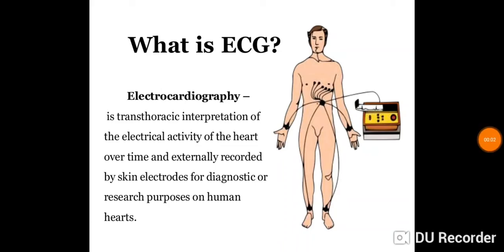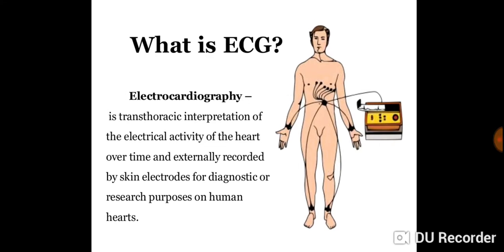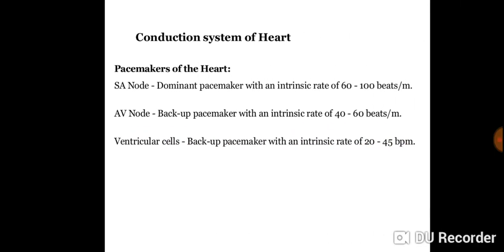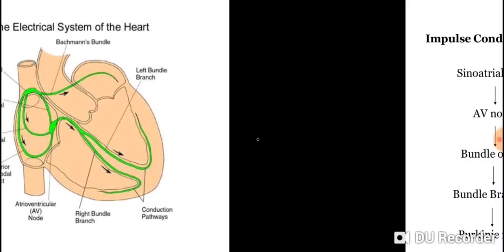Alright, let's try to make ECG easy. Now, ECG is a commonly tested subject in your final year MBBS exams, medical exams, FCPS Part 1, and other exams, PLABs, and whatnot. So let's get into it. The ECG records the electrical activity of the heart, and is known as EKG in the US.